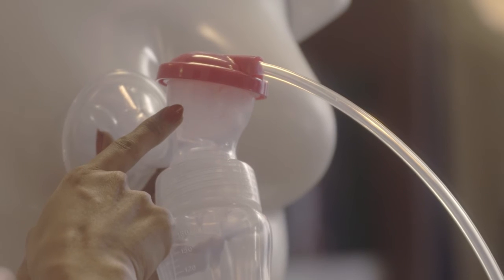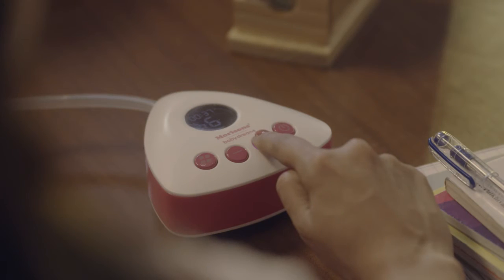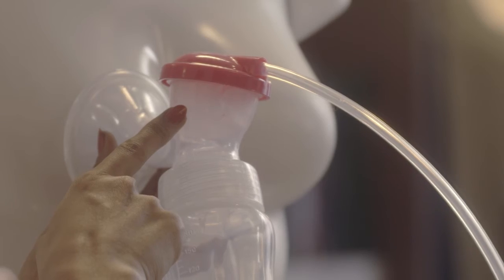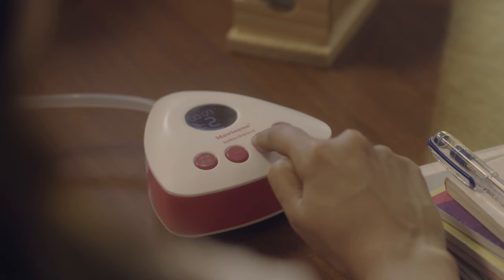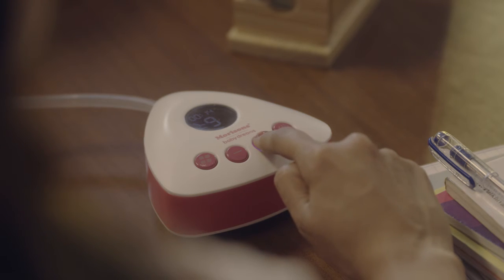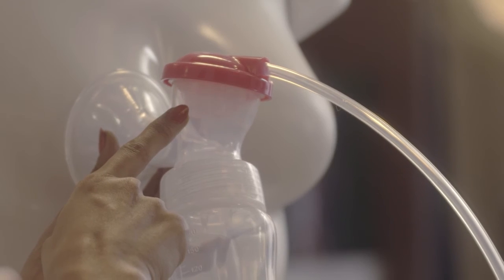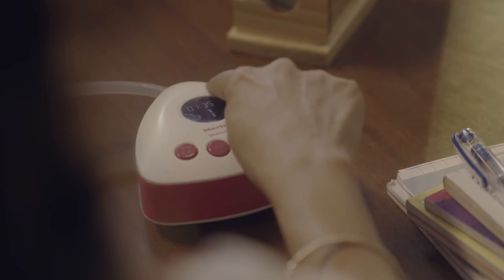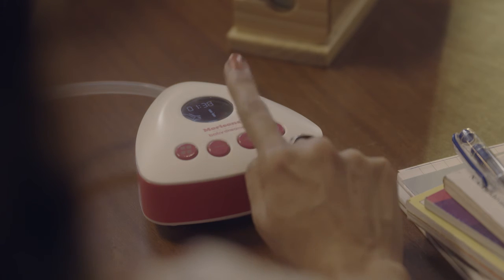After two minutes of warm-up, the mode will automatically change to suction. Once your milk starts flowing, press the plus button to deepen the suction or press the minus button to lower it, depending on how comfortable you are — up to nine levels altogether. The head of the pump mimics the sucking of a nursing baby, and the digital display screen indicates which mode you're using.